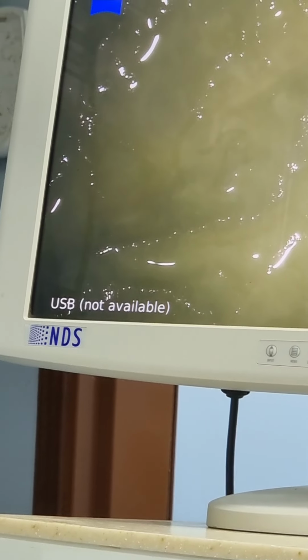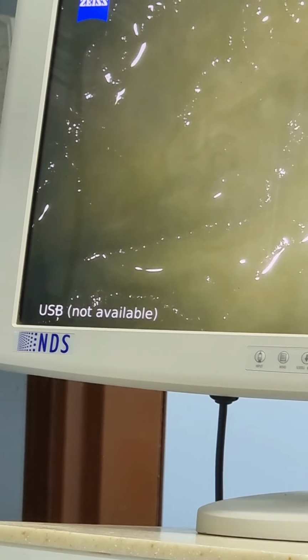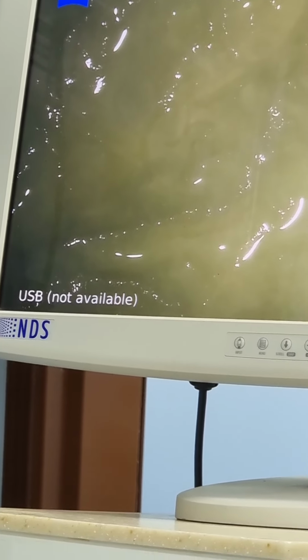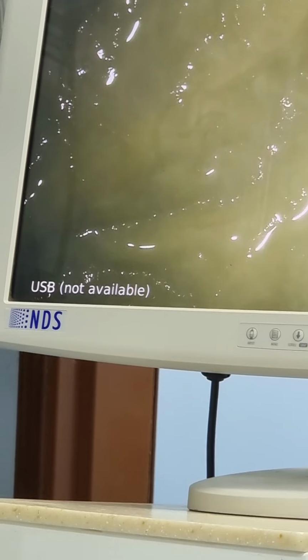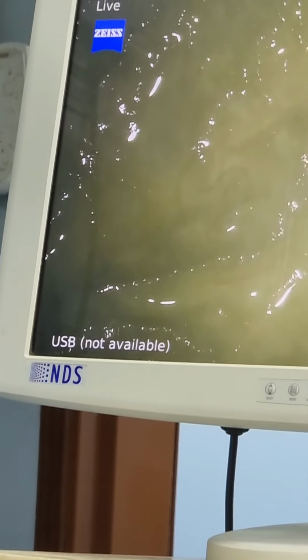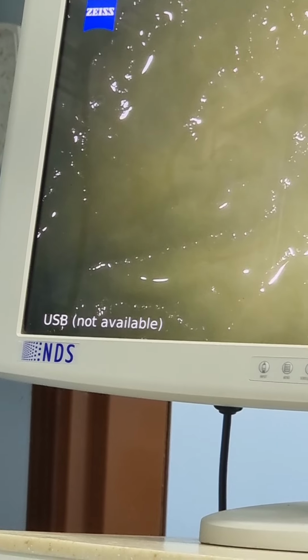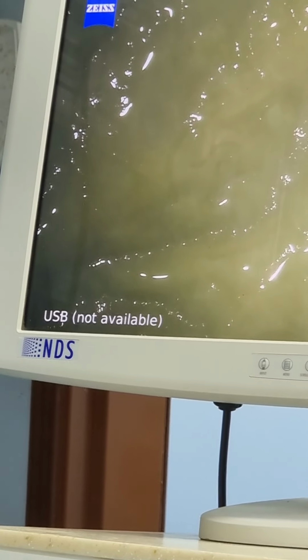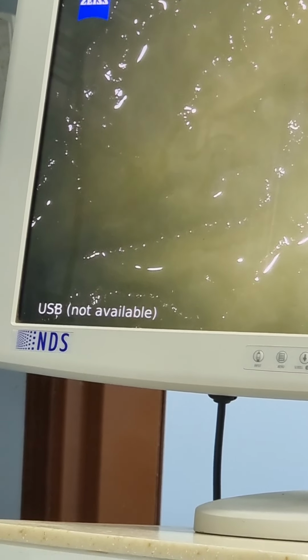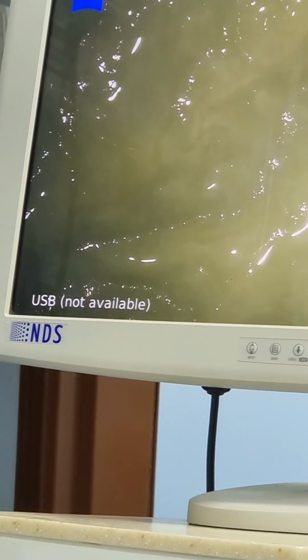What is this? This is the syringe with the nipple. And this solution, what I put here is water, but in clinics, this is sodium hypochlorite. That is the most commonly used irrigant. Now, what is the function of this? The primary function of these irrigants is disinfection of the root canal. Secondary function is to remove the debris out of the canal. So, how to use this irrigation syringe? First, you have to bend it.